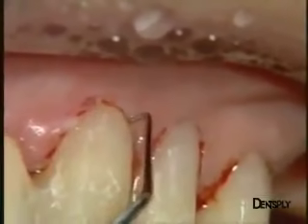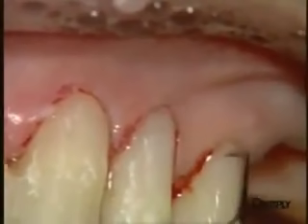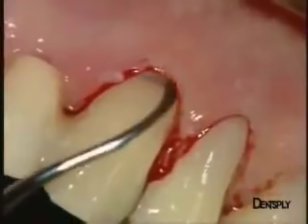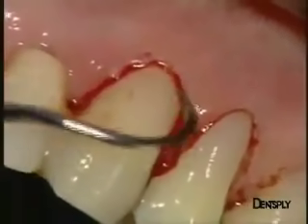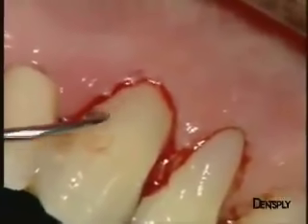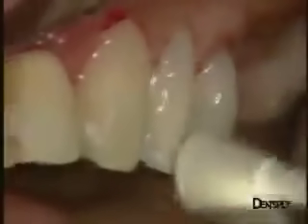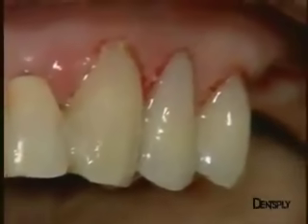Using a 17 probe, we will now find some undercuts in the cervical area. We eliminate them immediately with a burr held at 45 degrees to the crown to re-establish the cervical curvature. With a periodontal curette, we now eliminate remaining excess of material and check the final adaptation of the filling to the cavity. We then polish with a Pogo, used here with a water spray. We can decide whether or not to use spray with this polishing system, but we want to stress that with just one Pogo instrument we obtain a very satisfactory shine of the restorations.